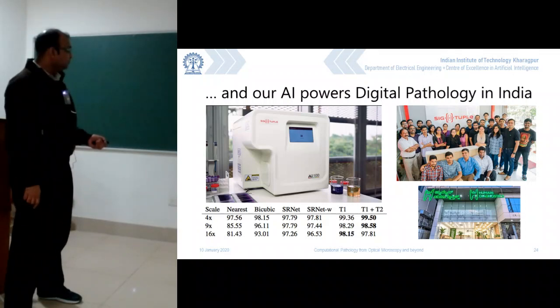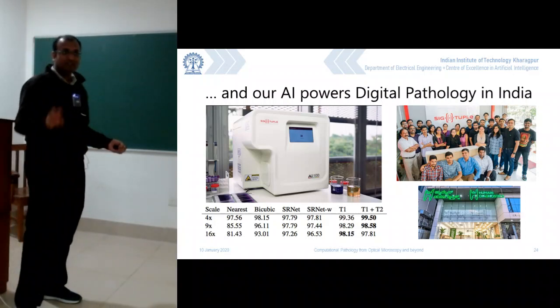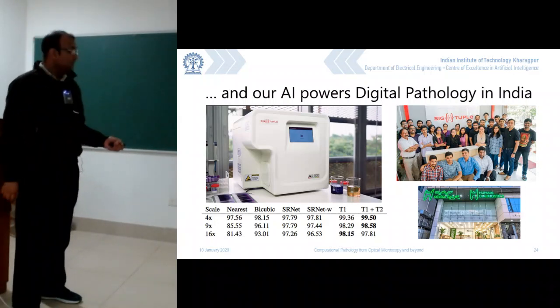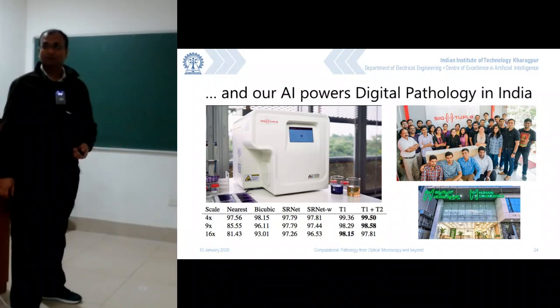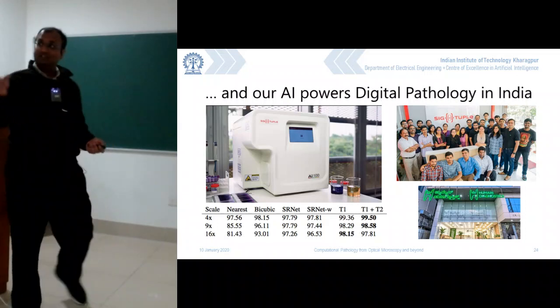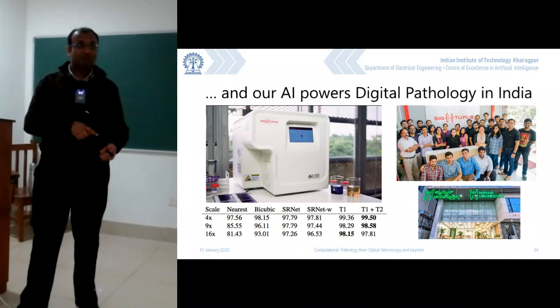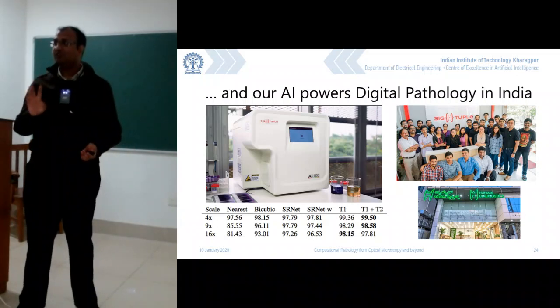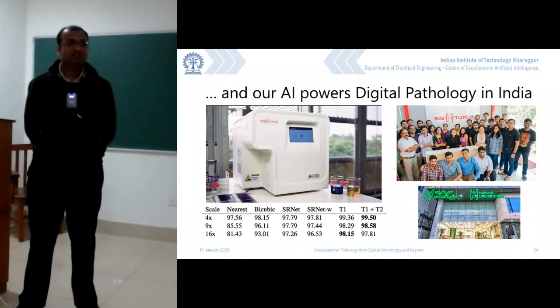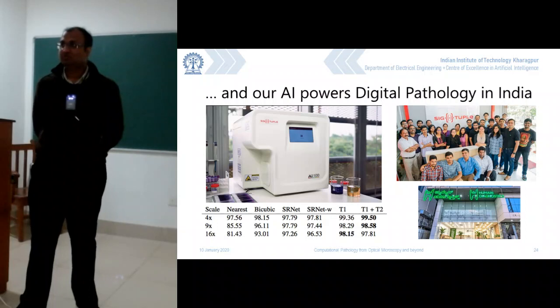Now there you would see that in the normal case it would have an 80% ability with just an interpolation problem in order to find out all of these specific cells. Whereas with our case it can go as high as 98%. Now imagine 16x means that it is 16 times faster as well to acquire. So we made something 16 times faster where the compromise was just under 2% on the performance accuracy, which is remarkably a different order in which you can get things done.